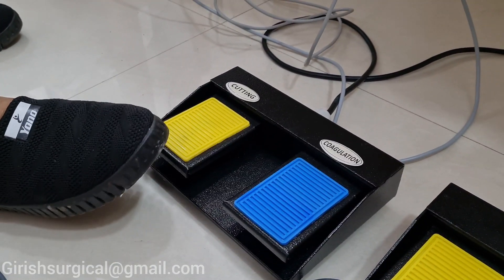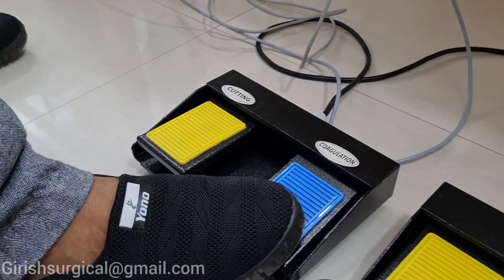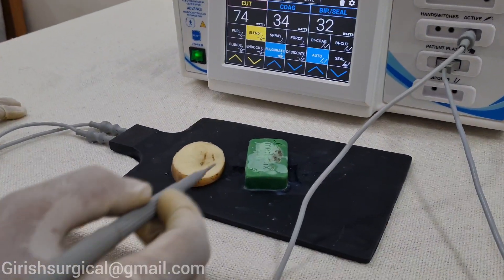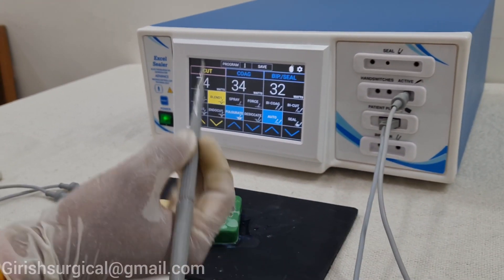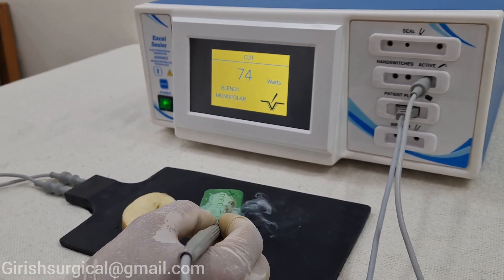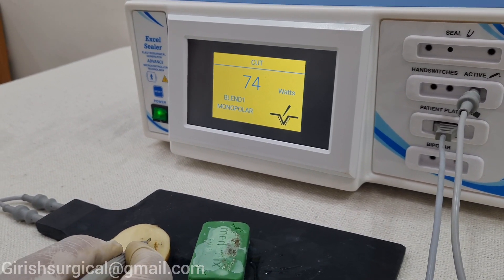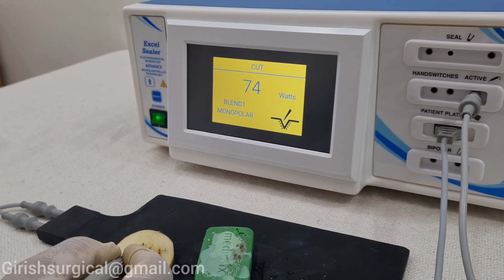There is the foot switch which is monopolar for cutting and coagulation, the sealed one, and this is for the bipolar. Now we are going to see how the monopolar foot control works. I am using the cutting mode. This I am doing non-touch — non-touch cutting.